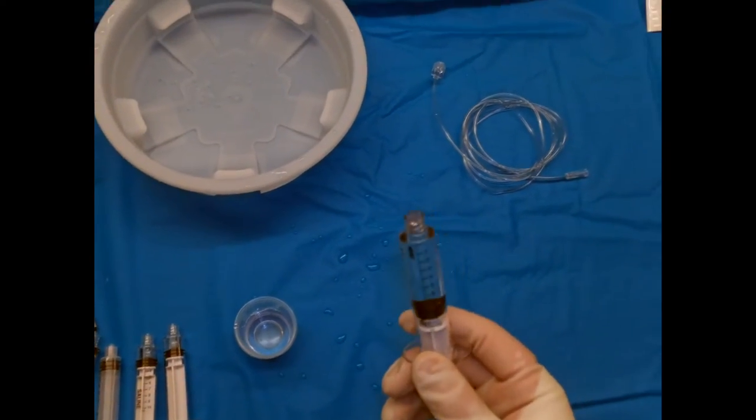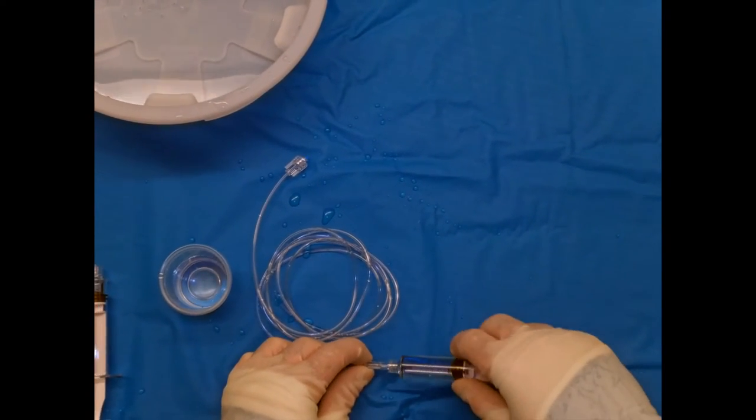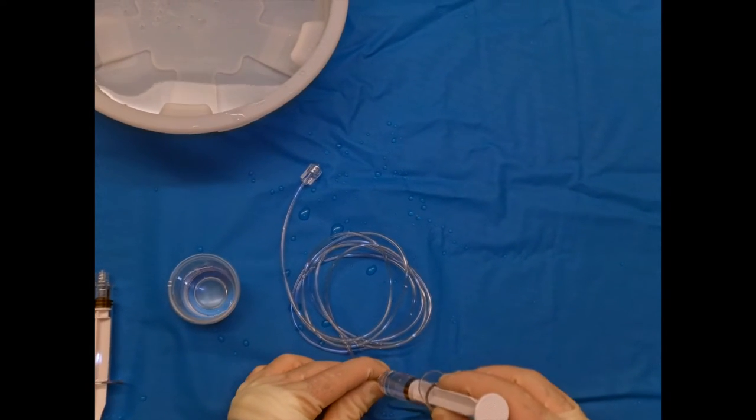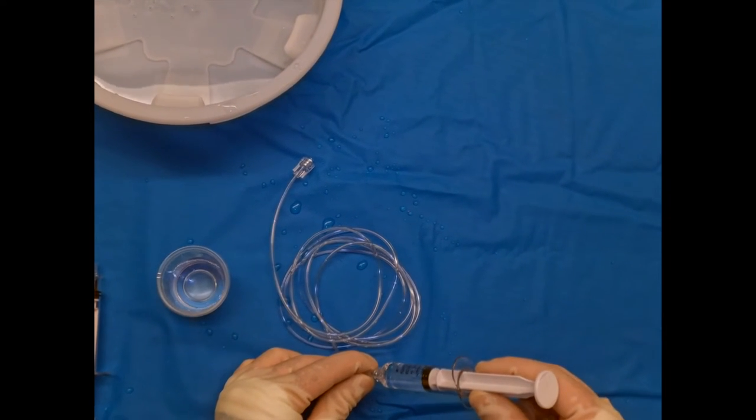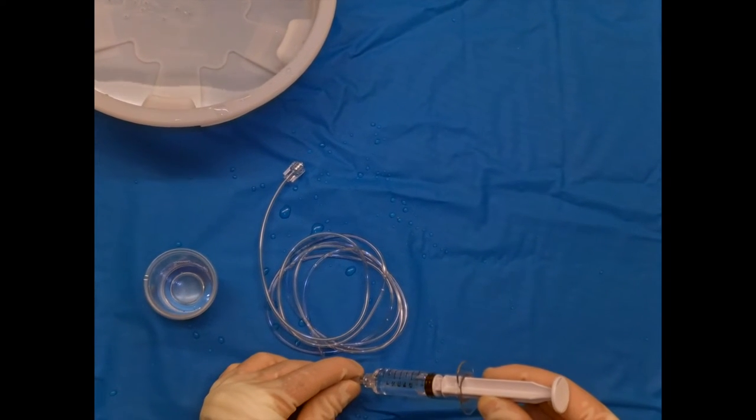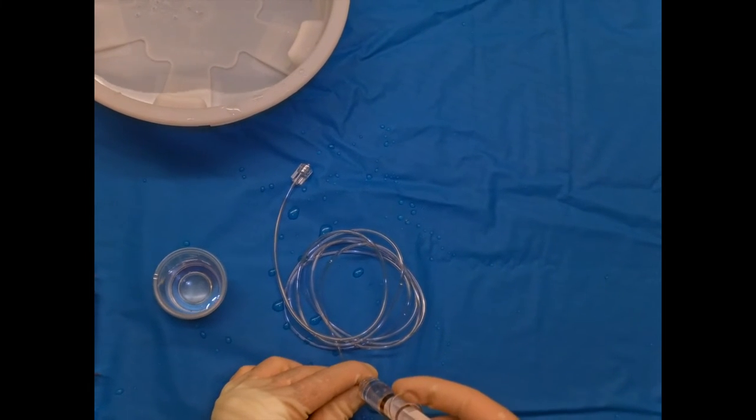Now when we hook this up to another line, what we can do is we'll now again face the back of the syringe up. As we pull back—I'll just show you, I'll tilt it for a bit—we pull the air out of the system, and then we can inject again in.